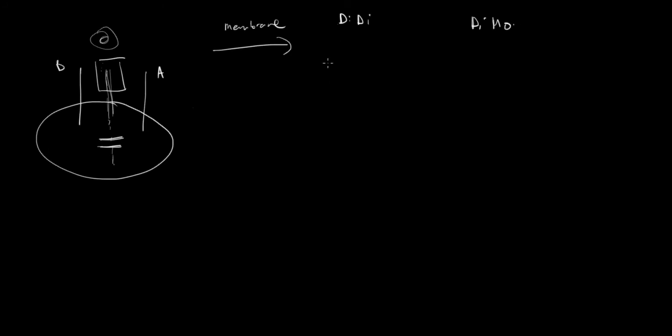In the diamniotic dichorionic twin placenta, what you'll see under the microscope is the amniocyte layer from twin A, and then beyond that you'll see some subamniotic connective tissue and the chorionic layer of twin A. And then you'll see very close to it the chorionic layer of twin B, and sometimes they actually fuse, and then you'll see the amniocyte layer of twin B. So amnion, chorion, amnion. What I tell my residents is, the second you have chorion in a dividing membrane, it's going to be a di-di.